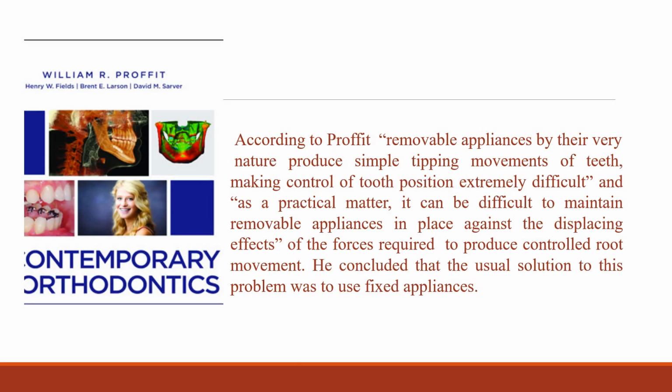Most orthodontic treatment is carried out using fixed appliances directly attached to the teeth. Development of this appliance system began in the USA at the turn of the 20th century, and they have become progressively more sophisticated. Fixed orthodontic appliances are required for accurate tooth positioning. The brackets, arch wires, and auxiliary components that make up a fixed appliance are responsible for mediating tooth movement, and these take place at the tooth bracket interface.